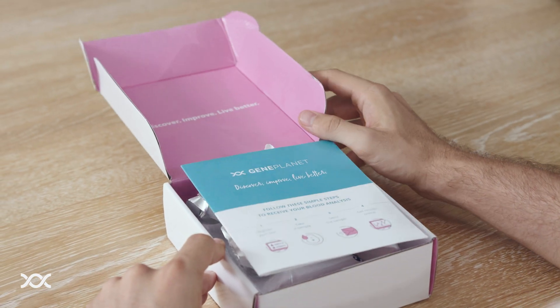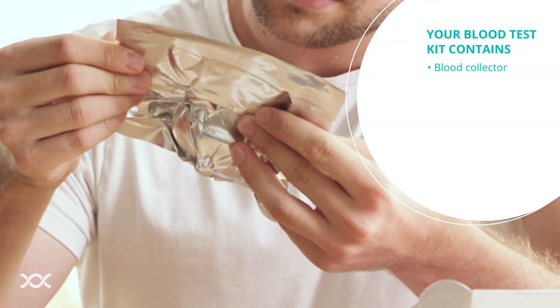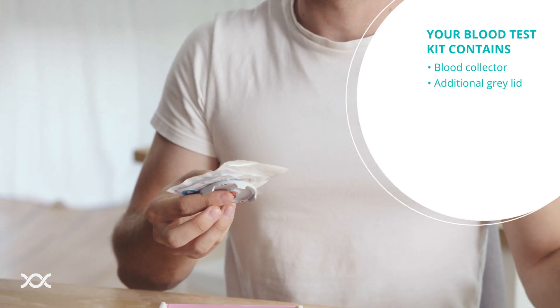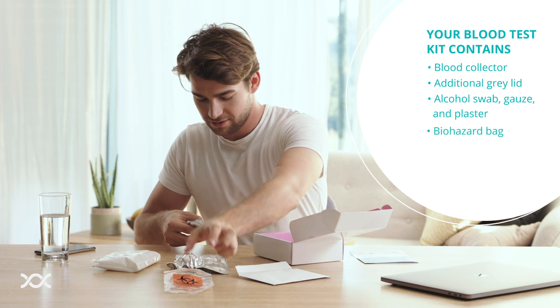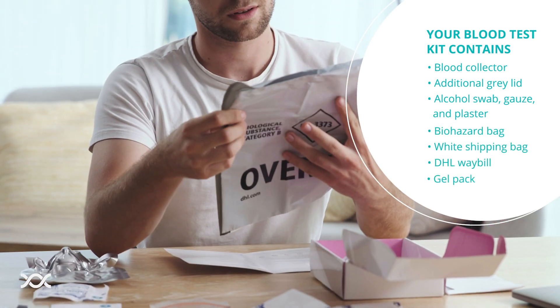Taking a blood sample is completely safe and virtually painless. Inside your blood test kit, you will find a blood collection device with the original gray lid in silver plastic packaging, an additional gray lid with a red rubber washer, and a barcode sticker, alcohol swab, gauze, plaster, and biohazard bag, white shipping bag, DHL waybill, and gel pack.